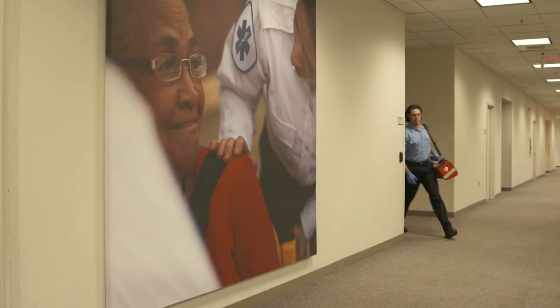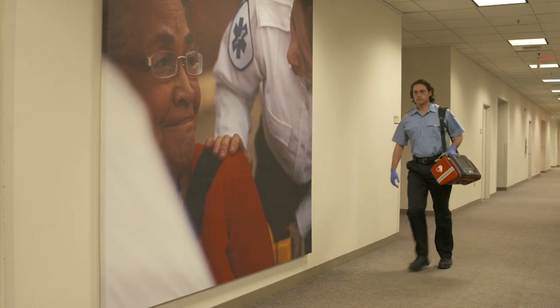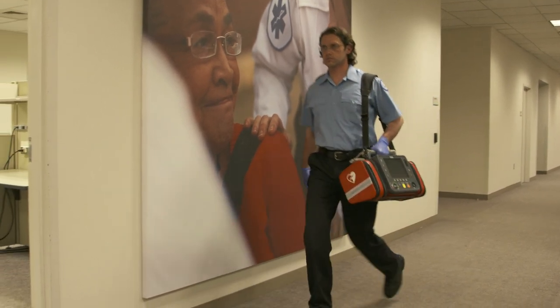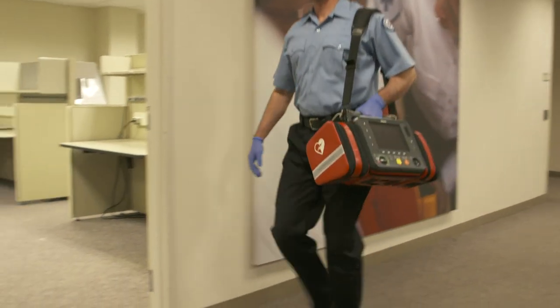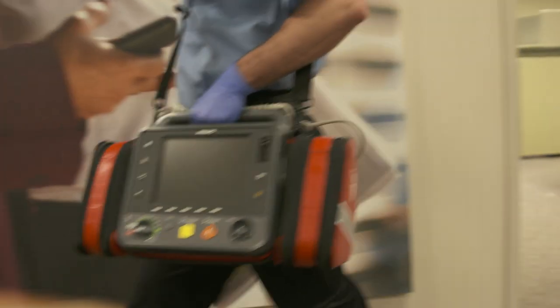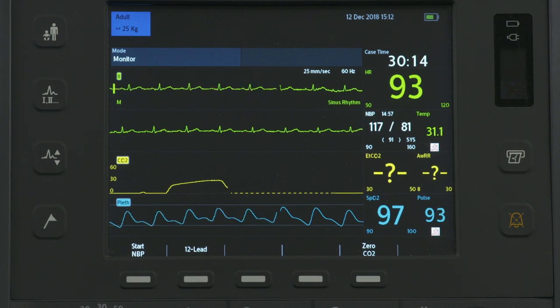The HeartStart Intrepid Monitor Defibrillator is a lightweight, portable, and versatile device designed to meet the advanced requirements of first responders in the emergency medical services or EMS environment, hospital code teams, nurses, and physicians. It combines a comprehensive set of features in an easy-to-use device with intuitive operation.